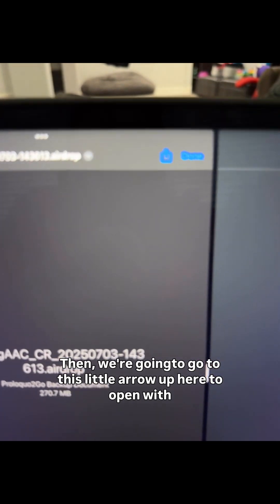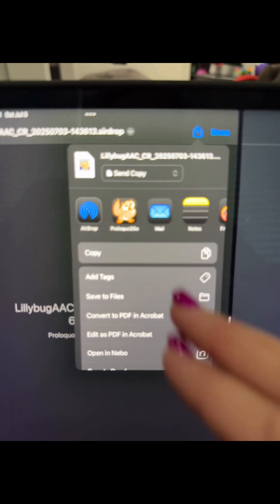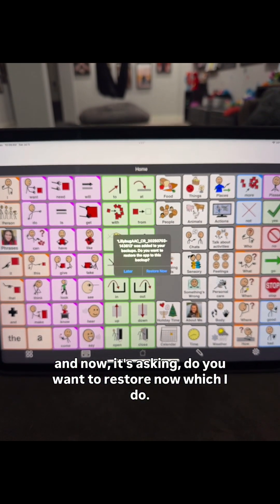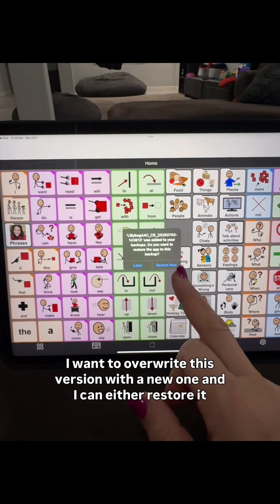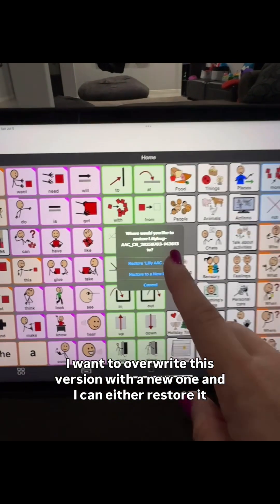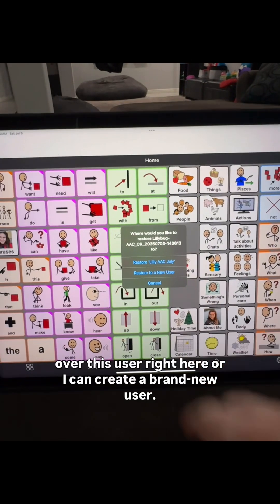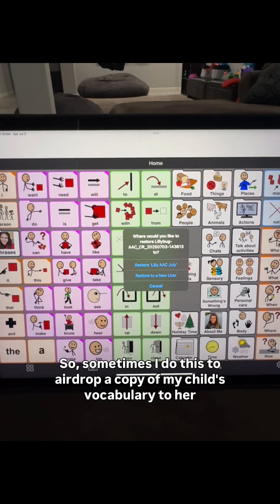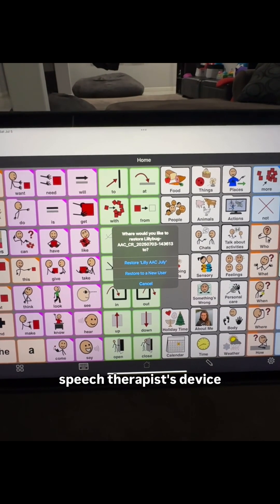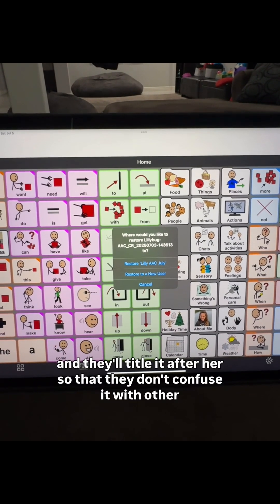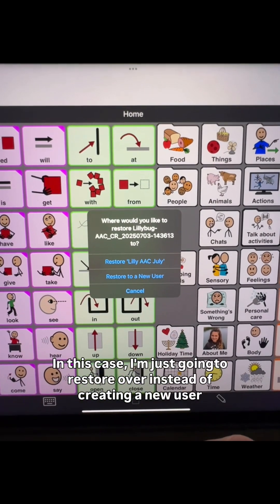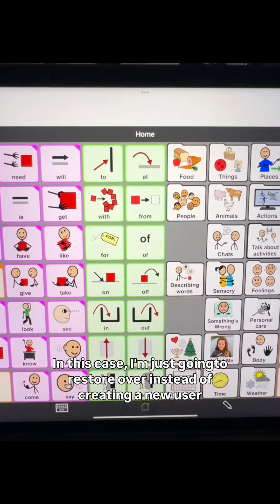Then we're going to go to this little arrow up here to open with Proloquo2Go. And now it's asking, do you want to restore now? Which I do — I want to overwrite this version with a new one. I can either restore it over this user right here, or I can create a brand new user. Sometimes I do this to AirDrop a copy of my child's vocabulary to her speech therapist's device, and they'll title it after her so they don't confuse it with other kids. In this case, I'm just going to restore over instead of creating a new user.